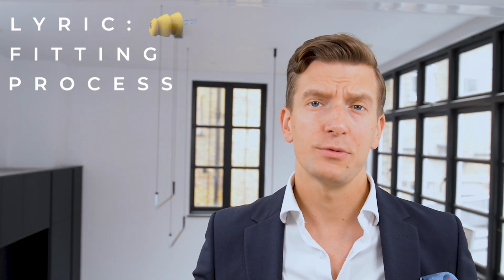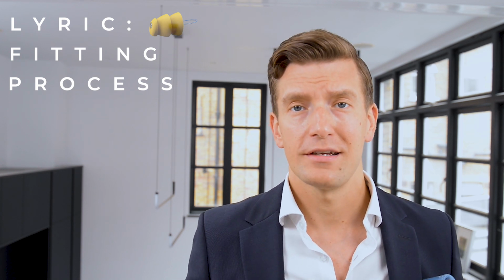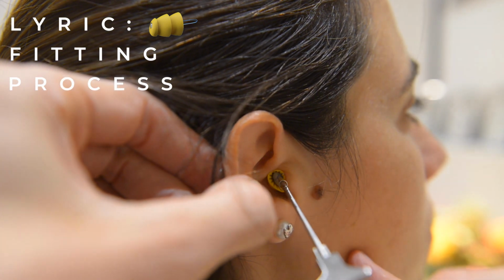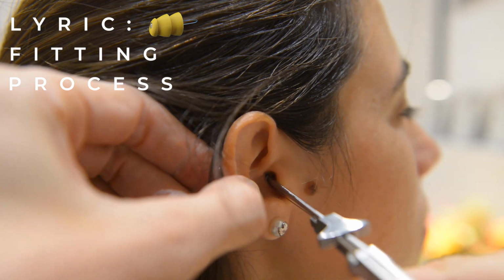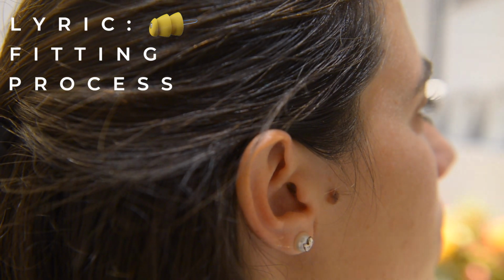Secondly, we have to establish which is the correct size of Lyric out of those 7 that we need to put in the ear canal. What I do is I'll start off with the very smallest size, so the extra small, and I'll gradually build up until we find a size which is appropriate. If it's too small, then sound can leak out and we'll get feedback. If it's too big, then we can get pressure points in the ears. So there's a nice comfortable sweet spot there in the middle.